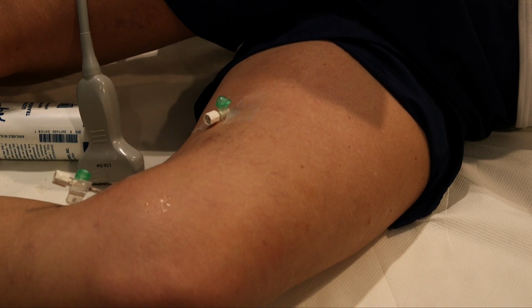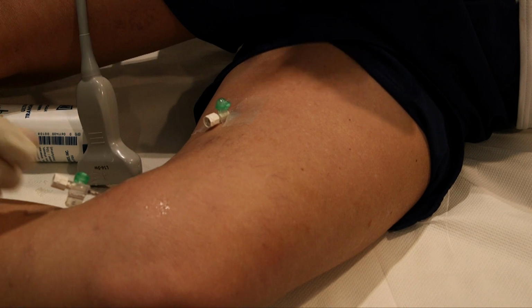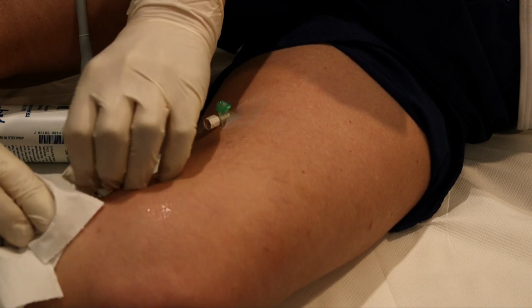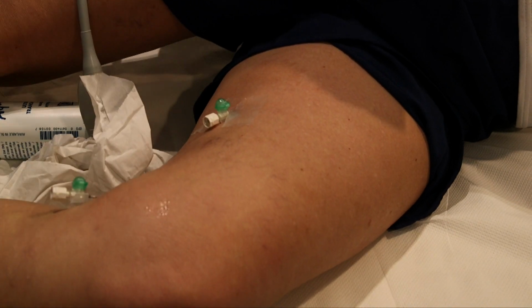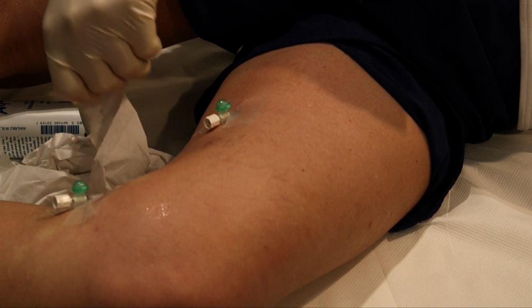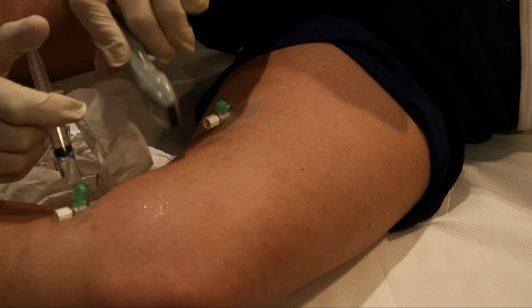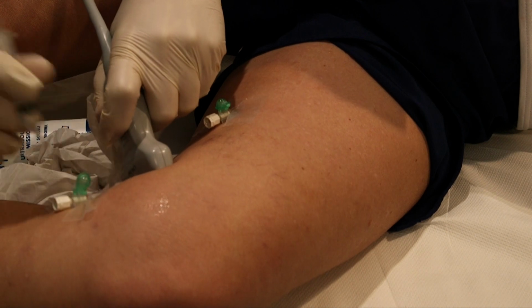In morbidly obese patients, I'm not very keen to treat varicose veins because of the increased risk of deep vein thrombosis. But even in relatively plump people, one of these will go in, and I tend not to use longer cannulas than this. So again, we can squirt some saline in and check that we're in the vein.